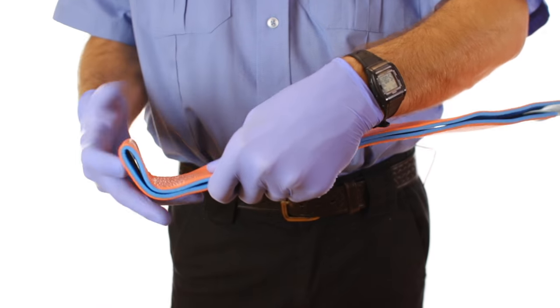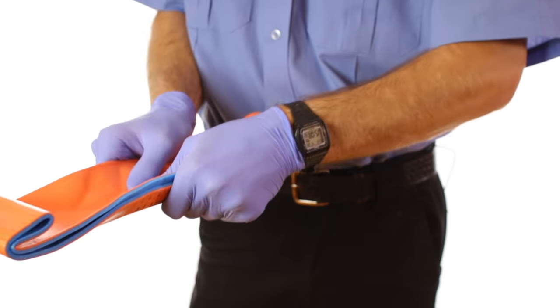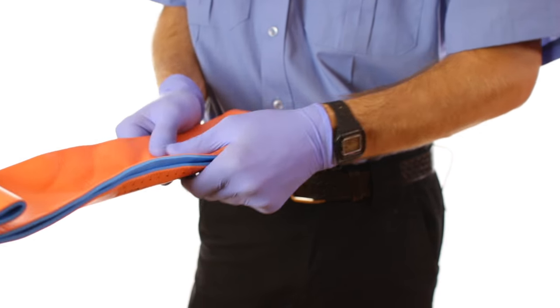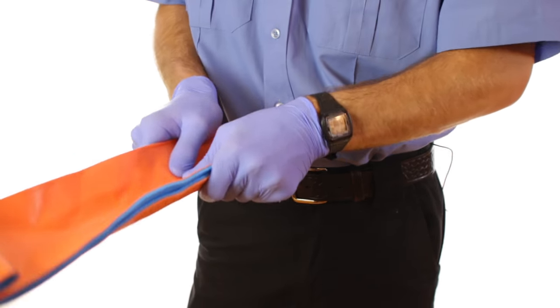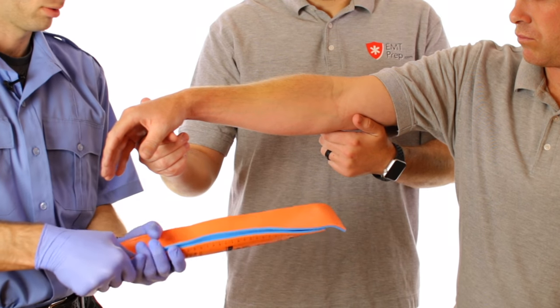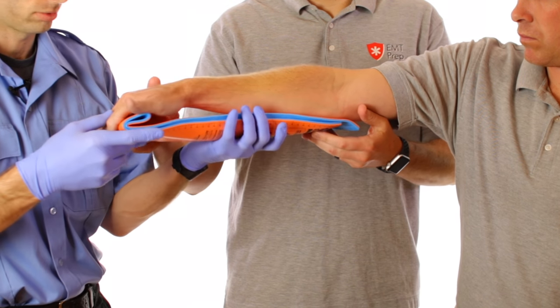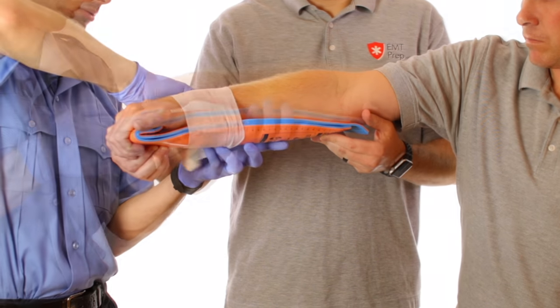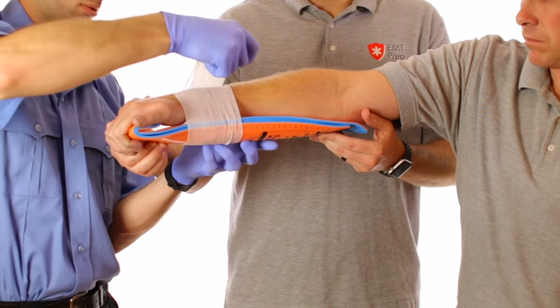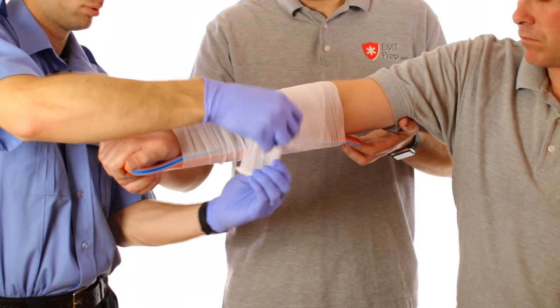Prepare your splint so it will properly fit the area you're going to be splinting. Gently apply it to the patient's skin while minimizing movement of the extremity. Using gauze or coban, secure the splint to the patient's extremity.